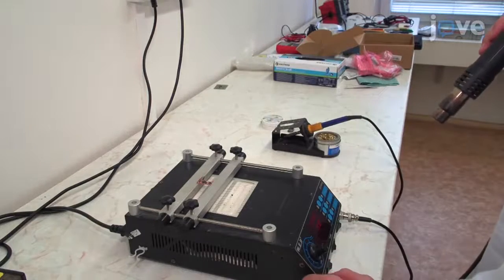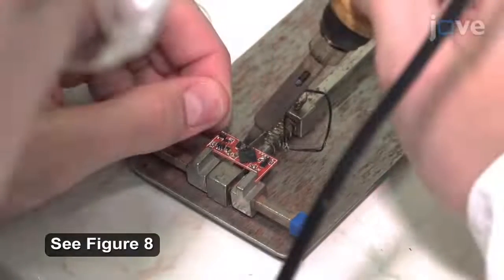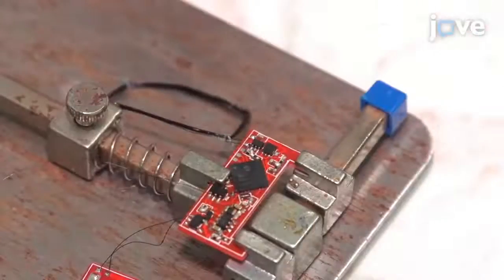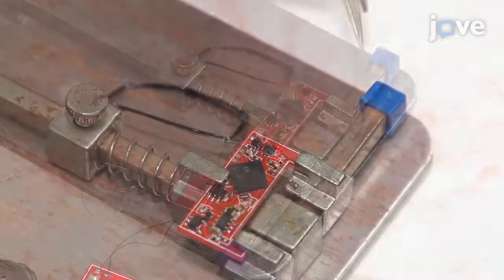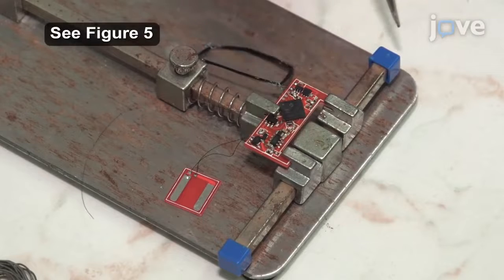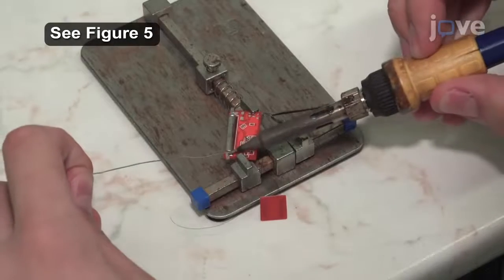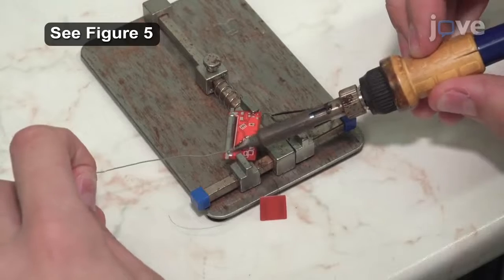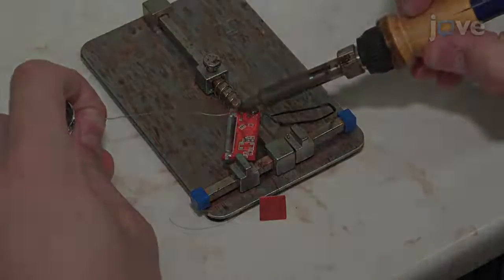room temperature. Connect the PCB to all other electrical components except for the battery. Solder the wireless charging communication coil to pads 2 and 3. Then connect the antenna to pad 1 and the PCB electrodes to pads number 4 and 5. Following that, solder the CG320 battery to pads 6 and 7. The negative terminal of the battery must be soldered onto pad 7.